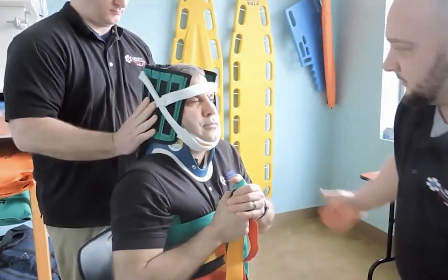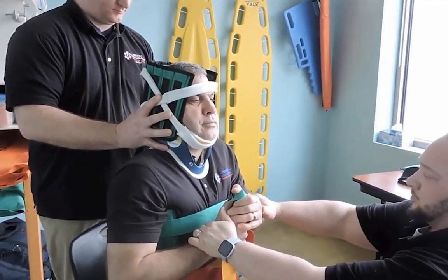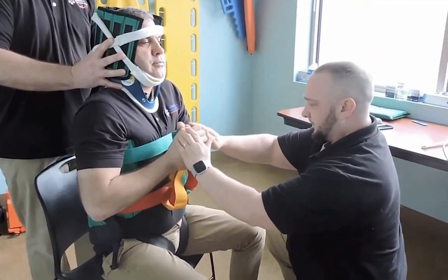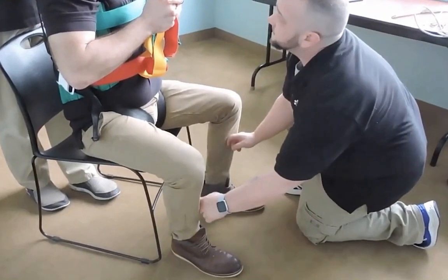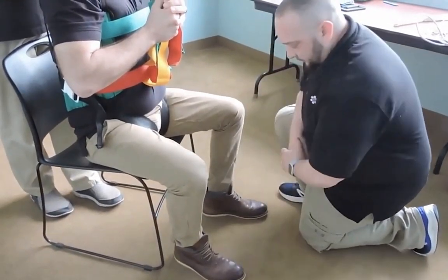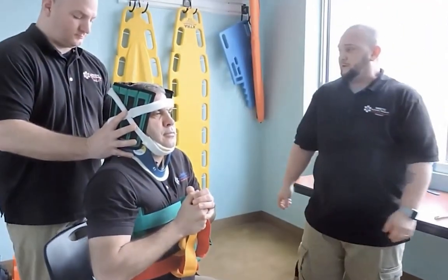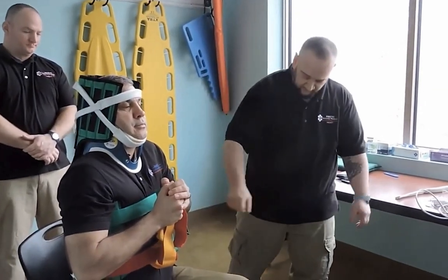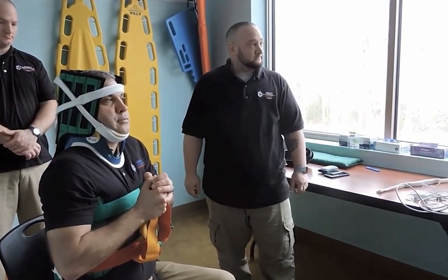My partner is going to continue to hold inline immobilization. We're going to check CSMs one more time. Good radial pulses equal on both sides — sir, you feel me touching you, and can you still squeeze my hands? All right. Moving down to the feet, checking for pedal pulses — you feel me touching that? Mm-hmm. And can you wiggle your toes for me? All right. So we still have positive CSMs. At this time, my partner can release inline immobilization. We're going to secure the patient to the longboard, release the leg straps, secure them with straps and head blocks to the longboard, transport them to the hospital, and transfer care to an equal or higher healthcare provider.